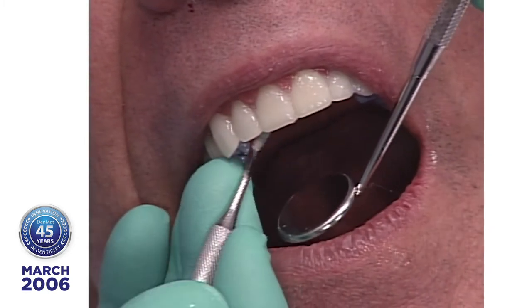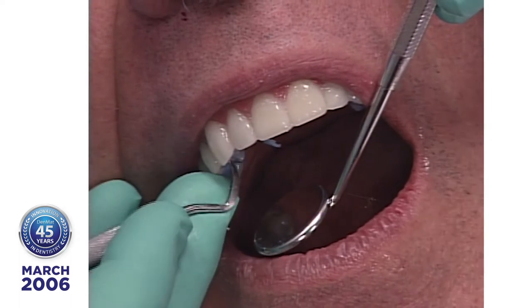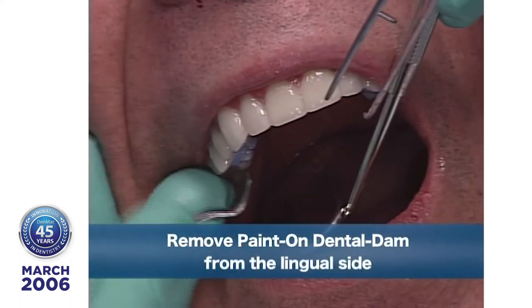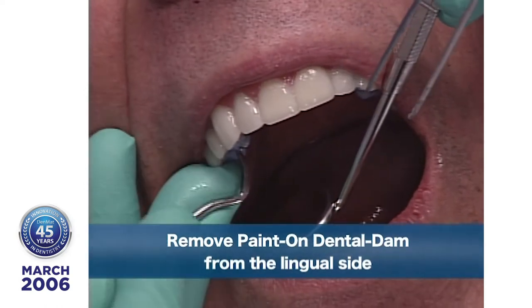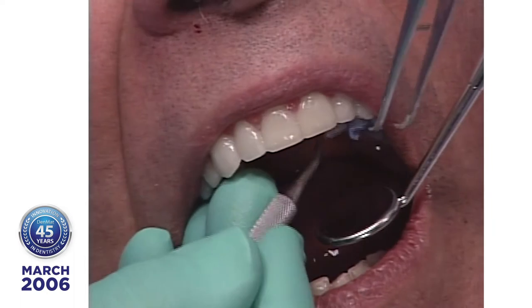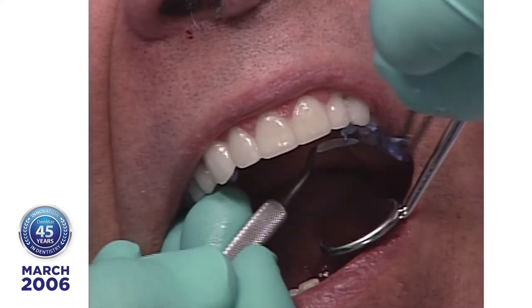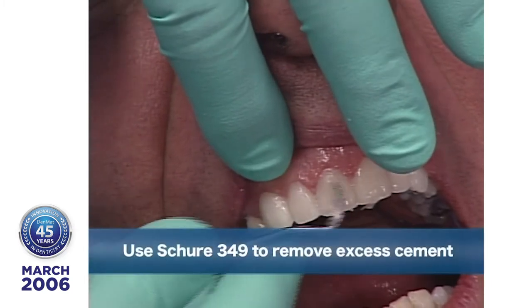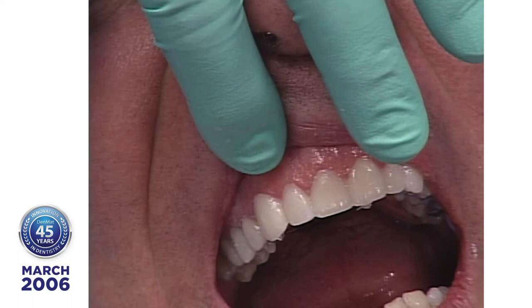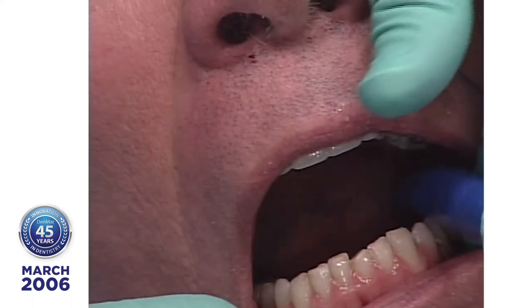Let's take a look at the lingual side here. And we'll start pulling off the paint on dental dam. Now, we've done two things. We've done surface preparation and we've done bonding. Well, now what I'm going to do is the lowers.